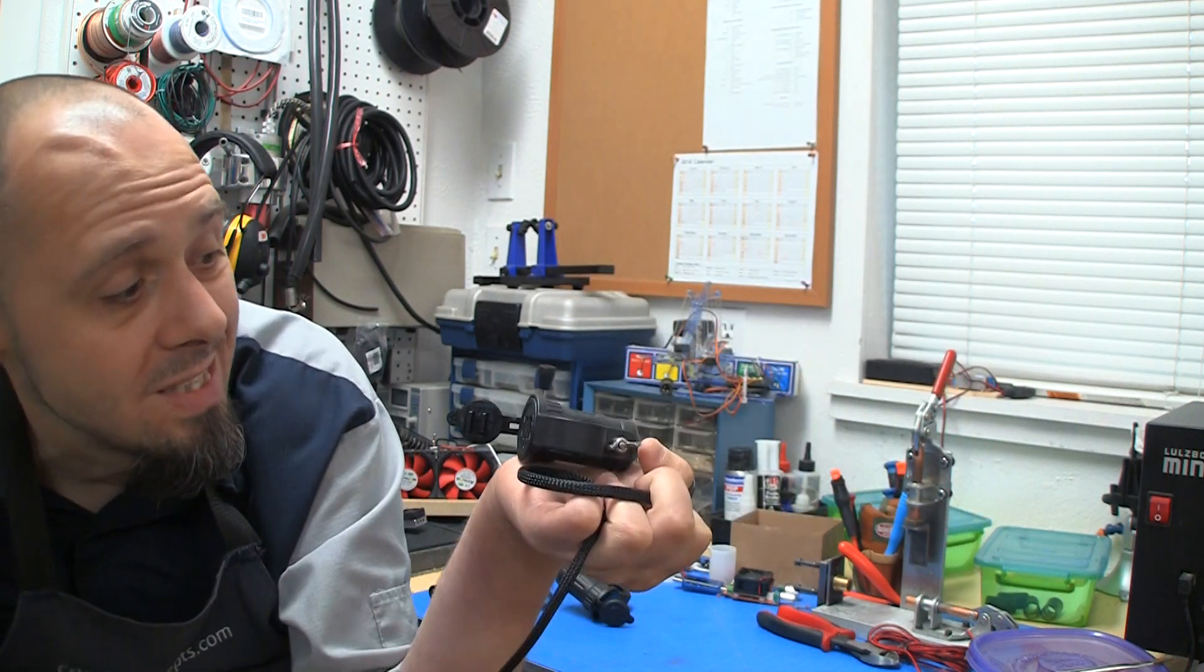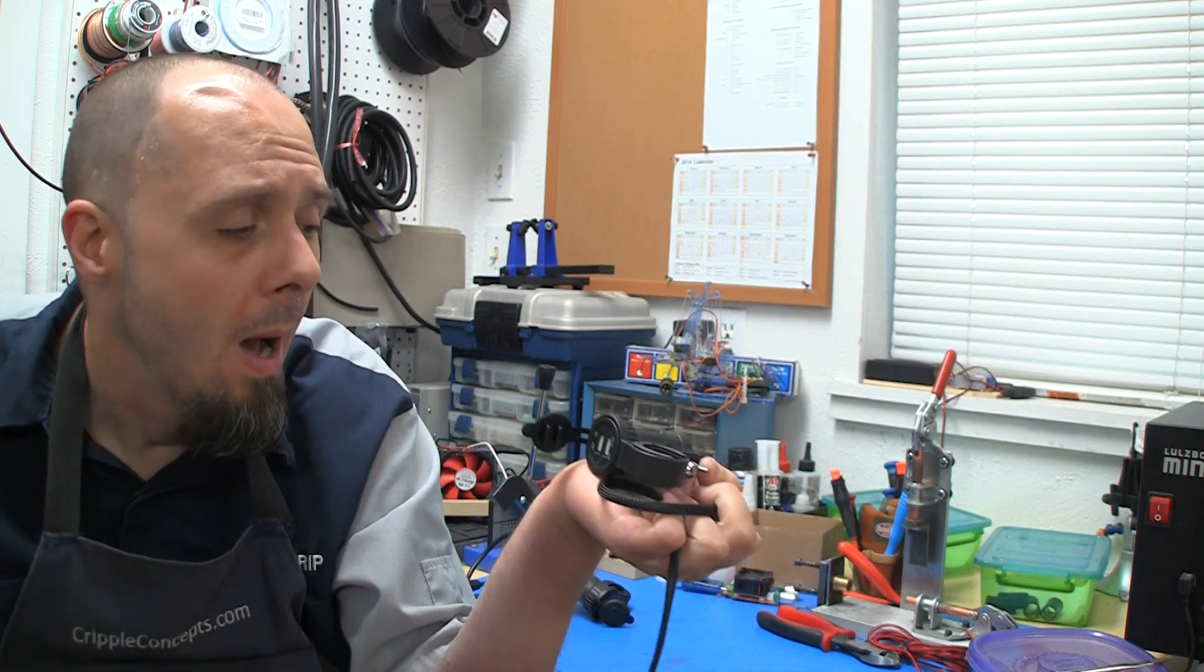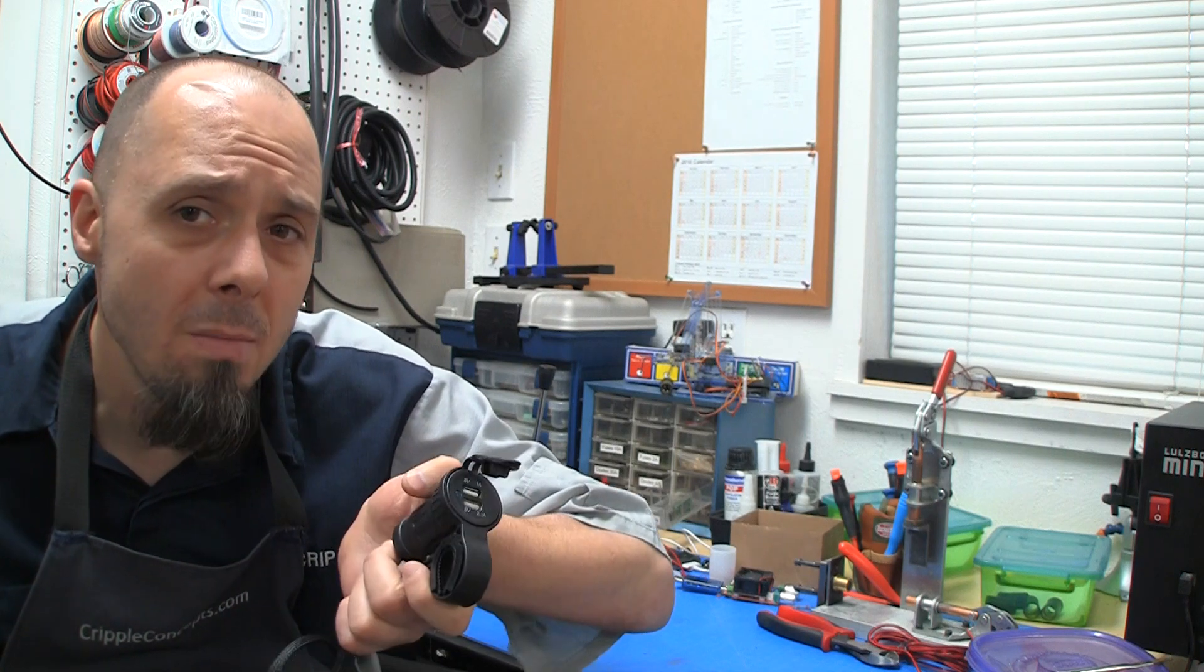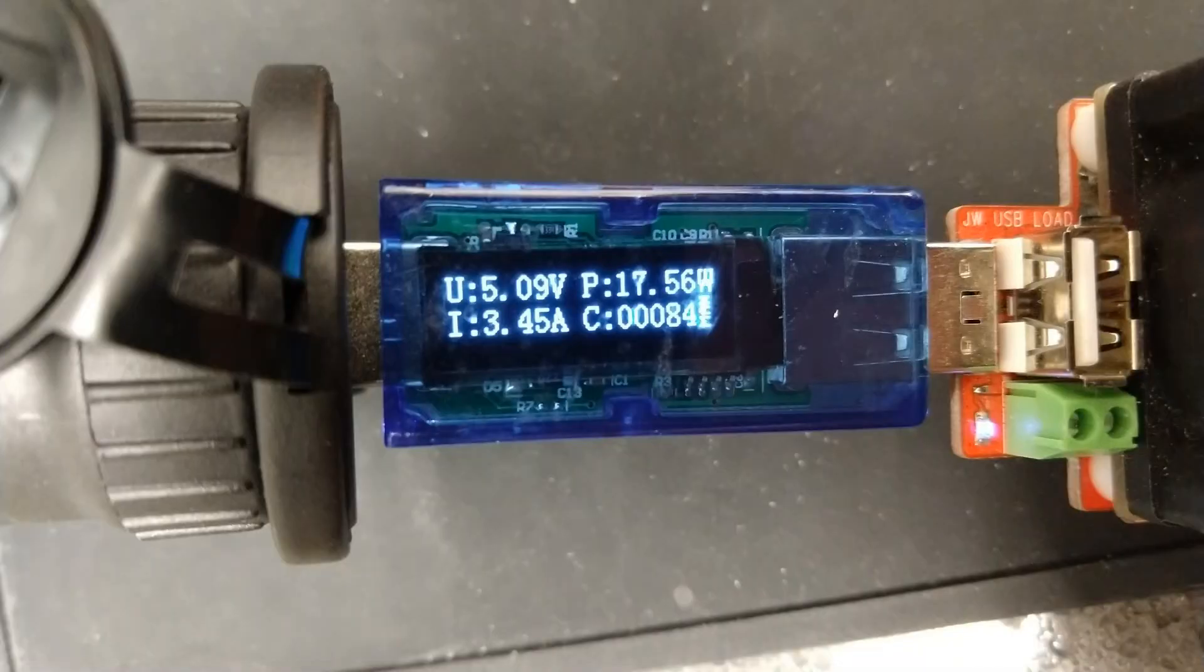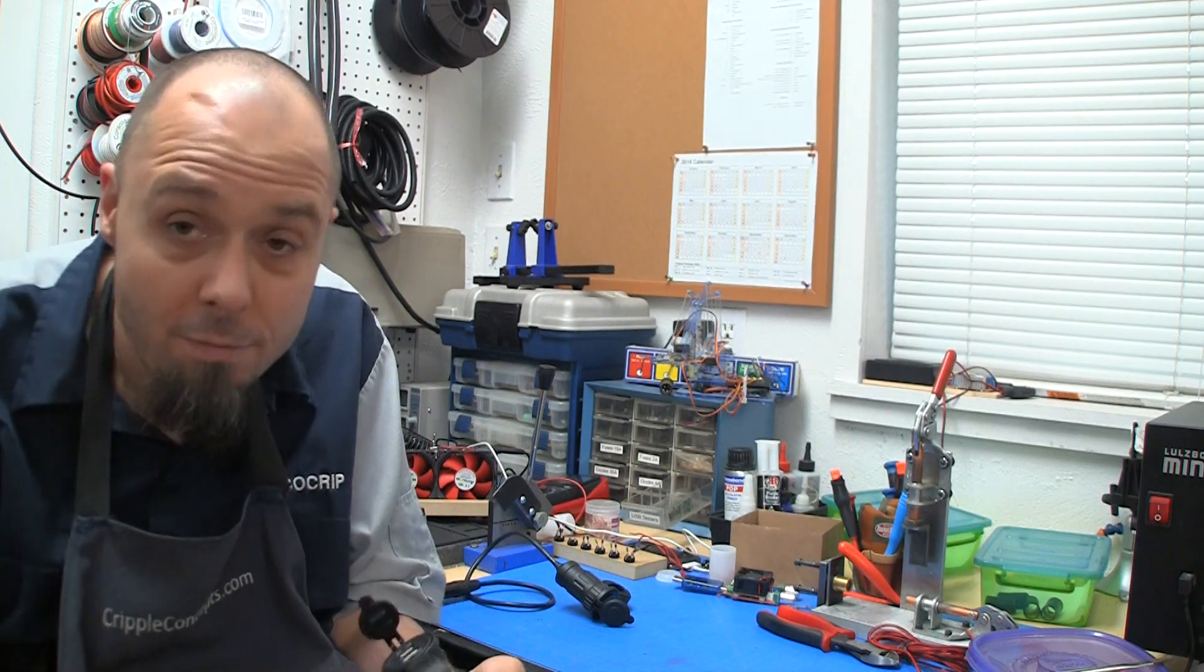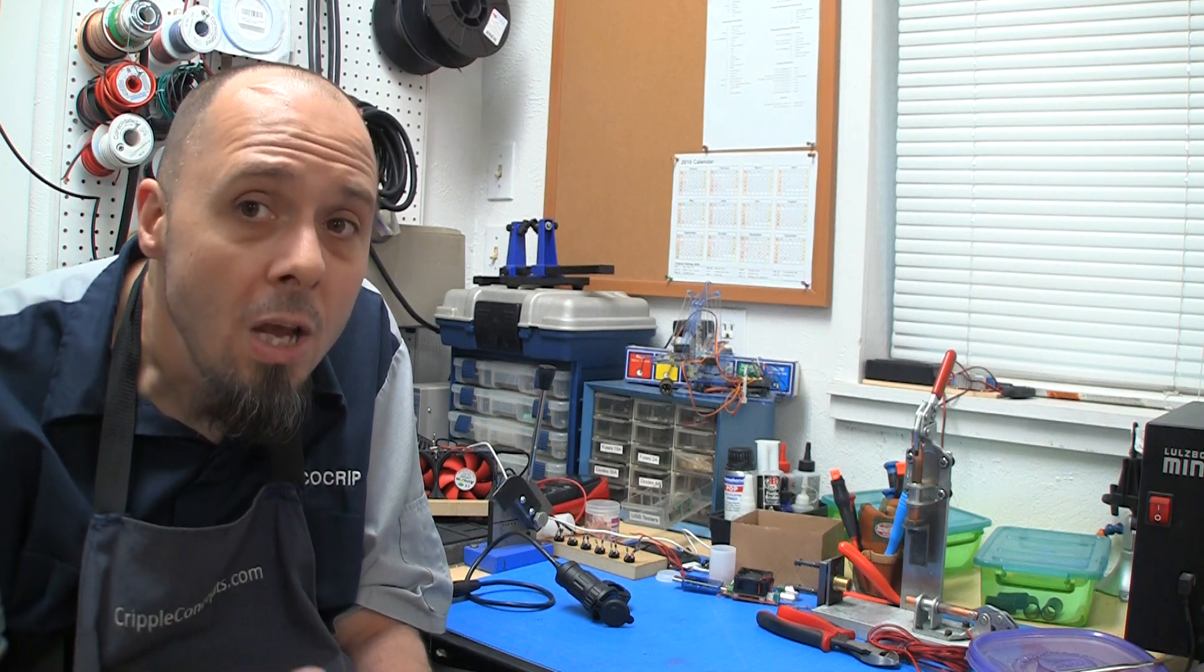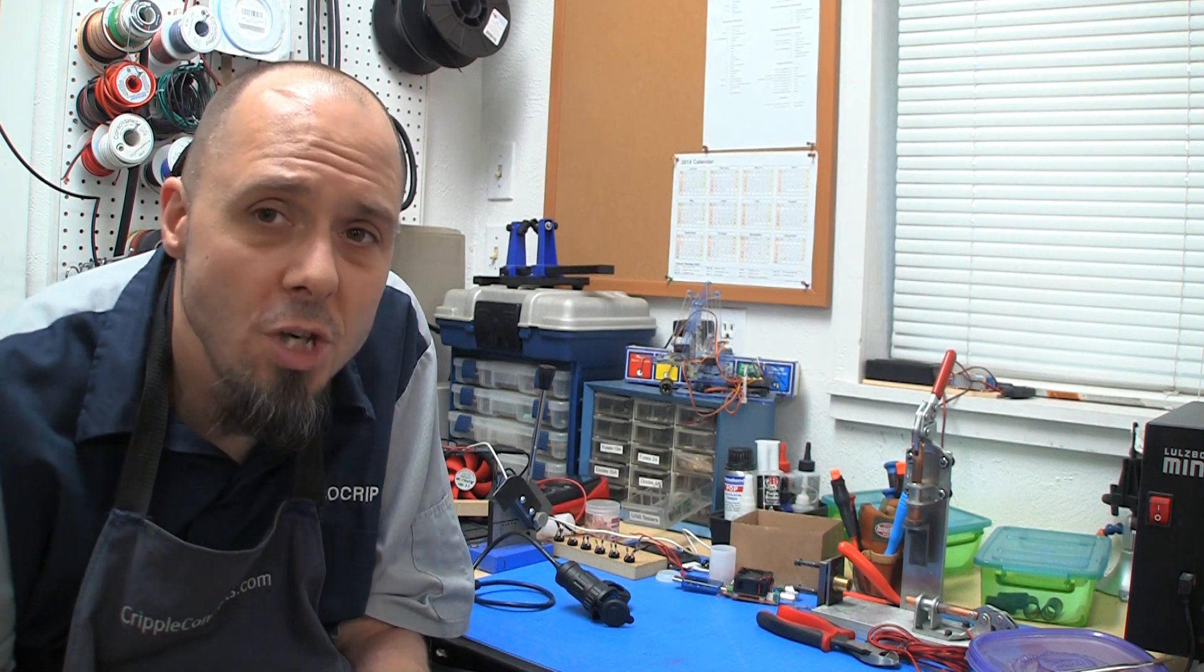It's fairly long and they come in a couple of different lengths. So anyway, it's got a one amp, what it says on here, what's silkscreen on here is 5 volt, 1 amp and 5 volt, 2.1 amp. So, here's the test results that I got. It only shows that it's good for the Apple 2.1 standard. So I took my little test device and I cranked 3.5 amps out of both ports on here and it didn't quit. It kept right on a chugging, which on one hand is really good.